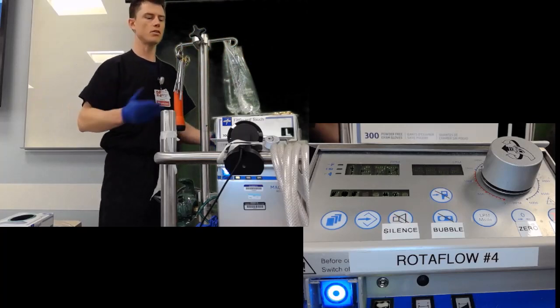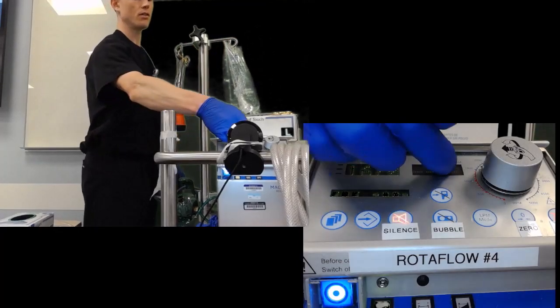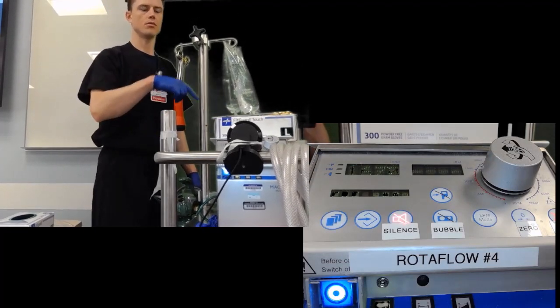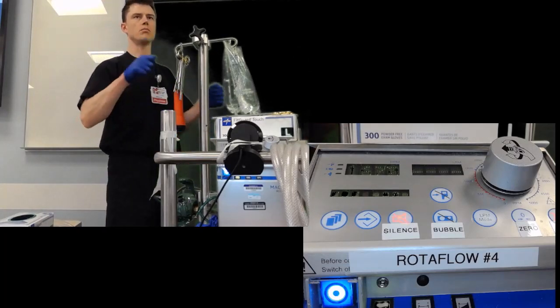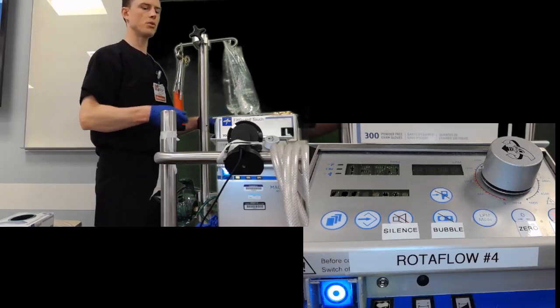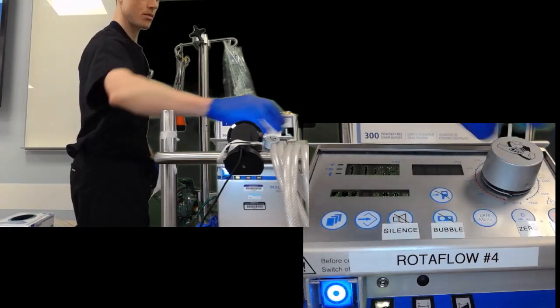All of a sudden, everything's fine, the patient looks fine, the stats look fine, and all of a sudden it starts alarming, and you see these lines coming across. It may be because it's out of gel. What we need to do is this one: never do this on your own because it can mess up the mechanics of the pump, but ask perfusion and they can help re-jelly it. But we'll do it here. So we'll just turn it down, we'll put some more jelly on so you can actually see.